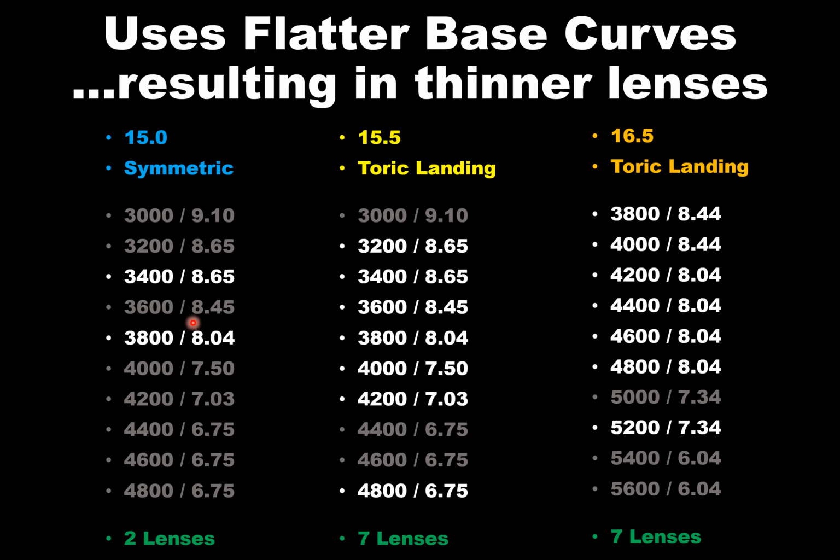And then using the diameters and the base curves in the SmartLens, you'll note that it's typical that you're putting a much flatter base curve of lens on eye. Why is this important to you? It's important because your patients aren't going to need powers of -16 diopters when they're a keratoconic steep cornea.